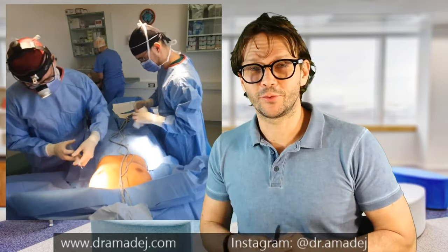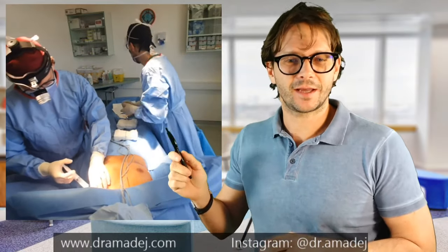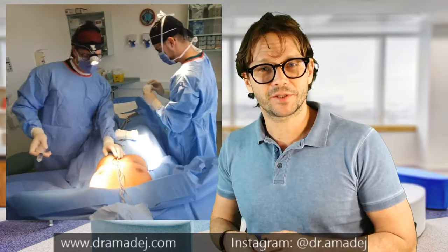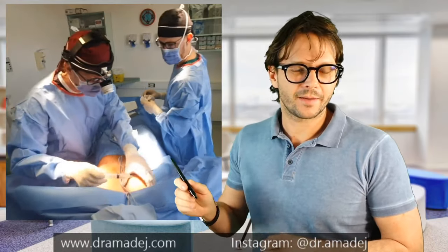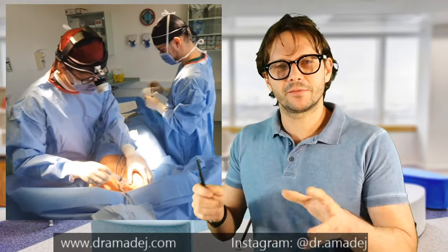Hello and welcome to 'Boobs' — your favorite plastic surgery show. I'm doing a video today about real breast augmentation surgery while I am injecting the local anesthetic.